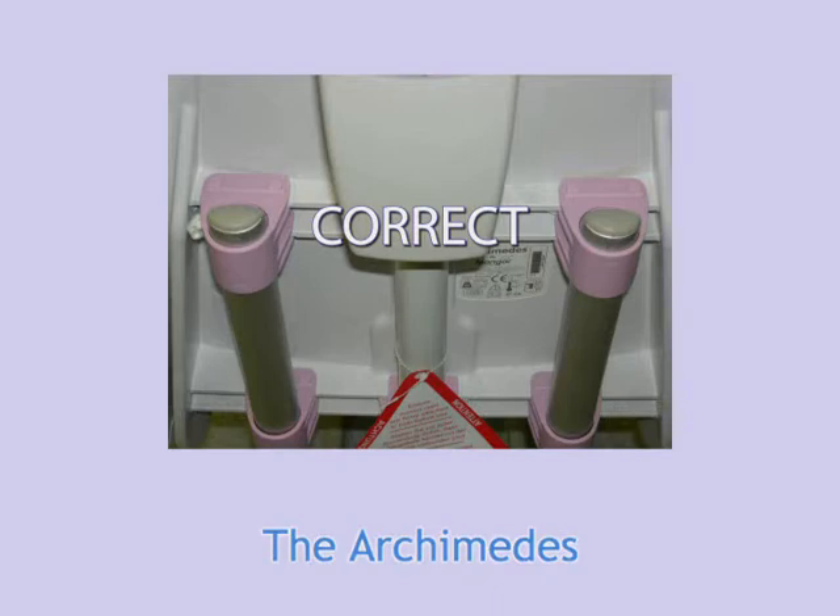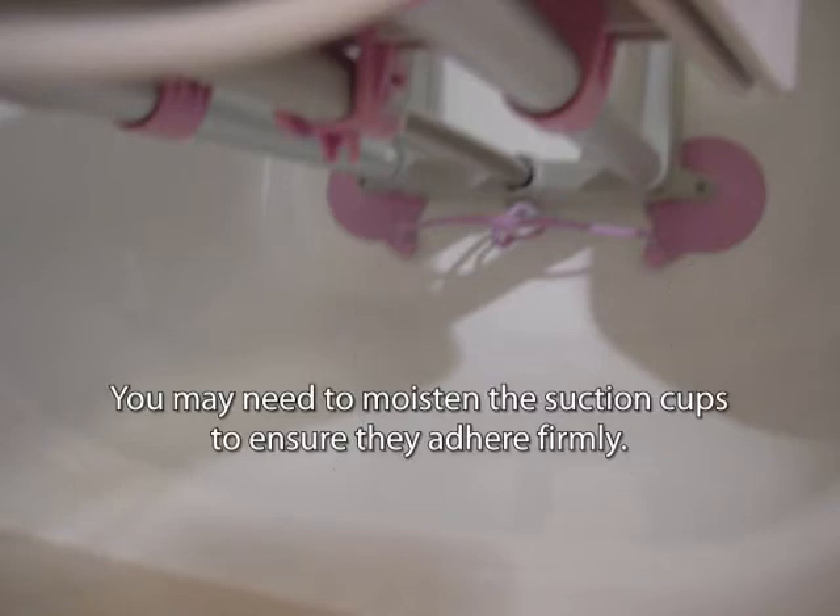Before each use, check to see that the seat can slide freely up and down on the support tubes. Place the Archimedes at the end of the tub away from the faucets, making sure the suction cups are on the flat part of the tub bottom. You may need to moisten the suction cups to ensure that they adhere firmly to the tub.